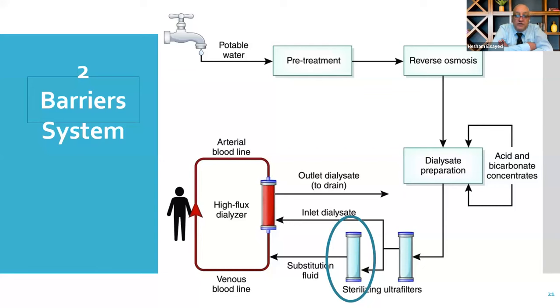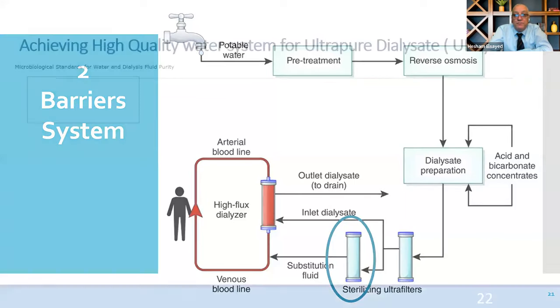So what do you think about that? If you are using a filter for 100 sessions, we have to control it frequently with the water treatment station to ensure that the least amount of bacteria and endotoxin are coming through. So this is a final guard, but the previous steps are also very important.